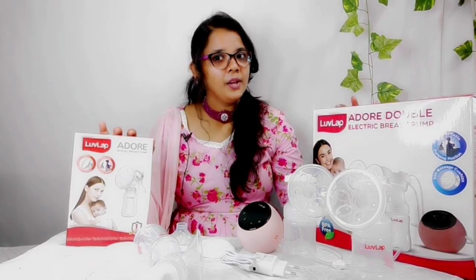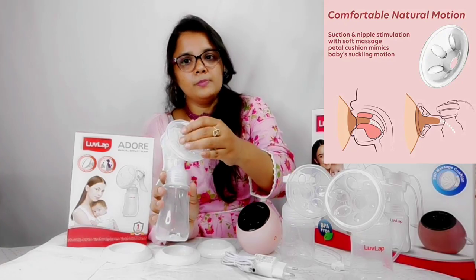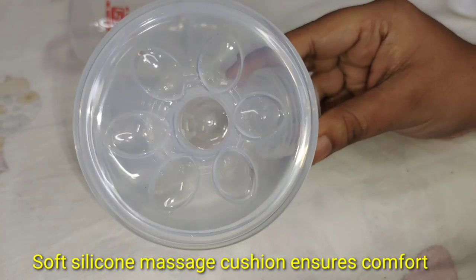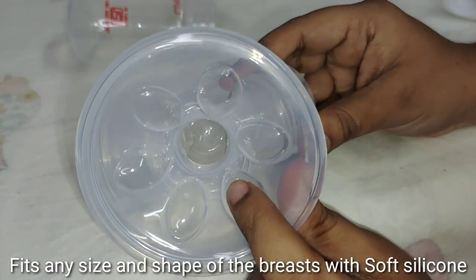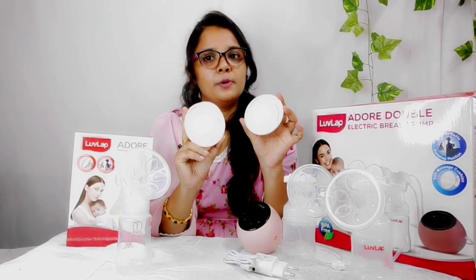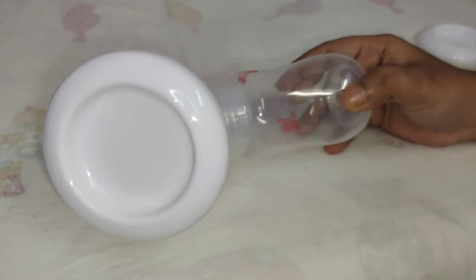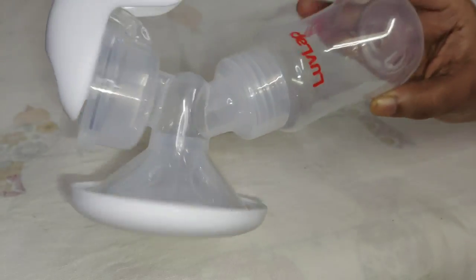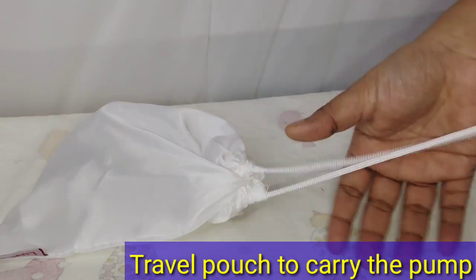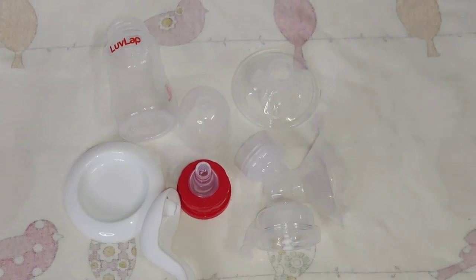Both the electric and manual breast pumps have a silicone suction to create a comfort zone. They also come with dust protection caps, so once you pump you can close the cap to keep the milk dust-free. Every attachment is BPA-free, and all parts can be sterilized by boiling.